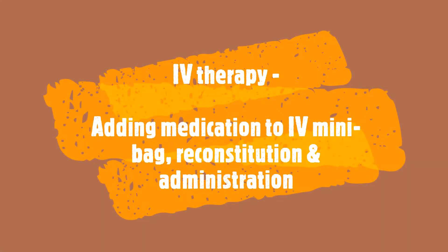Hi everybody, this is Carlos. In today's video, we're going to go over IV therapy, adding medication to an IV mini bag, reconstitution, and administration.